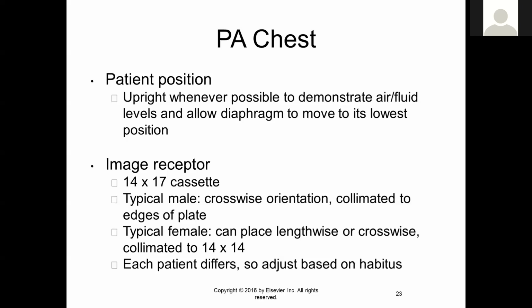So if you have radiation going past the margins of the cassette or the detector, then it's just extra radiation dose to your patient because there's nothing to actually receive that image. So it is crucial that the light field, the radiation field, must never exceed the dimensions of the cassette or the detector.